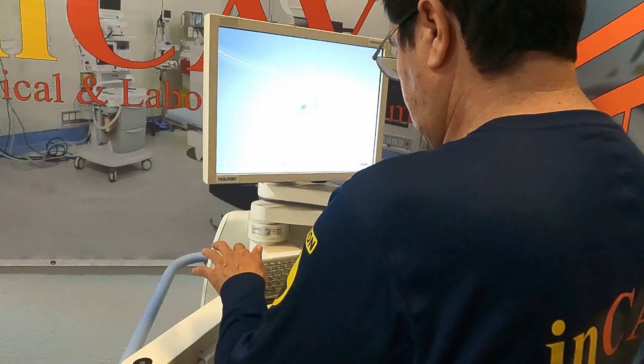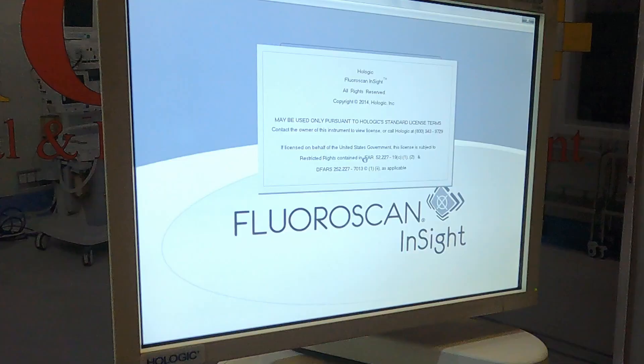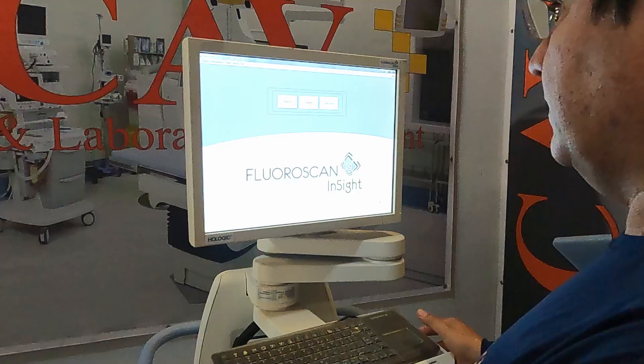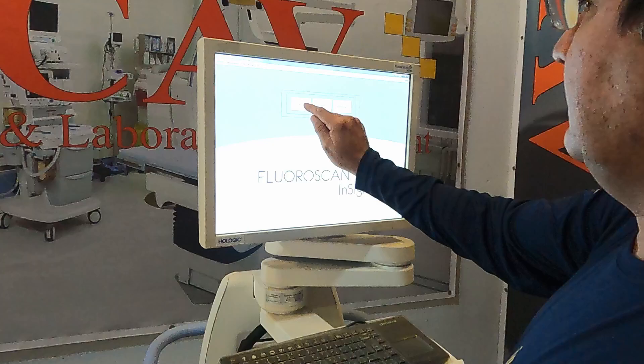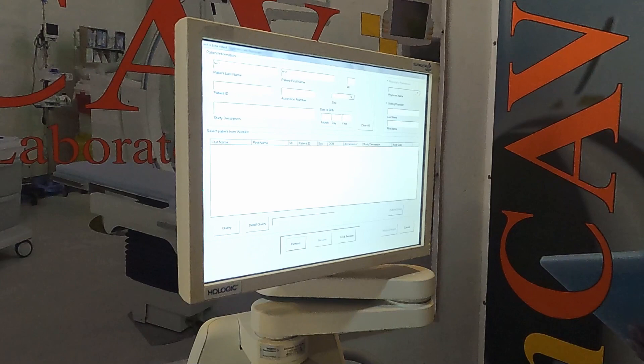Now we are going to log in to open the application. On the main menu, click on the perform or examination button to open the patient registration screen. Now we register our new patient. We put in all the information and when we are ready, click on perform to enter shooting mode.